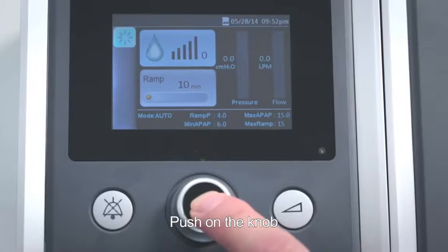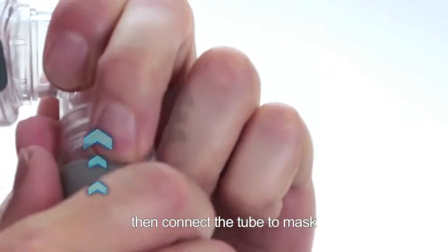Push on the knob to start the air blowing, then connect the tube to the mask. Lie down and adjust the mask again if necessary.